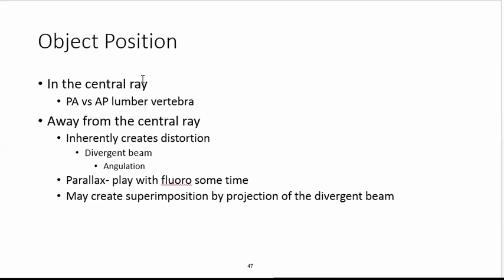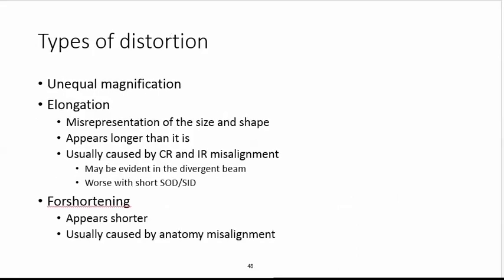The reason for that is because in that area, right in the middle of the radiation field, they know exactly where the needle's going. If you get the tip of the needle outside of that, then there's really no telling where the needle's going. It's really dependent on how deep the needle is already inside of the patient's back, where the patient's spine is in relationship to their back. They just can't tell, so they need to see it right in the middle. Anywhere else gives them a parallax effect, and they can't predict exactly where they're sticking the needle. That's a bad situation if you're a patient too.